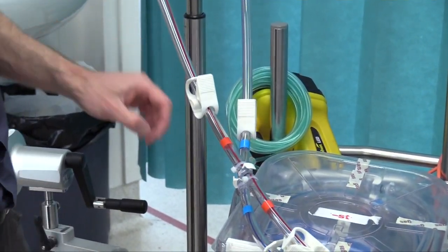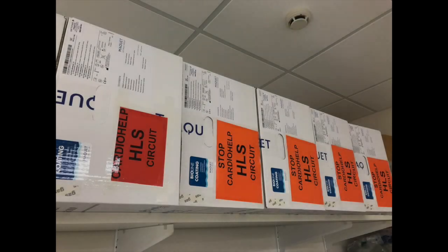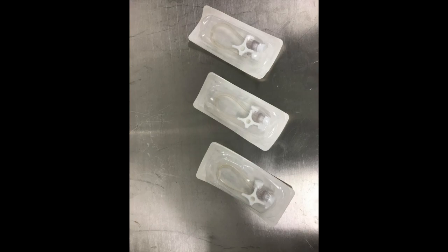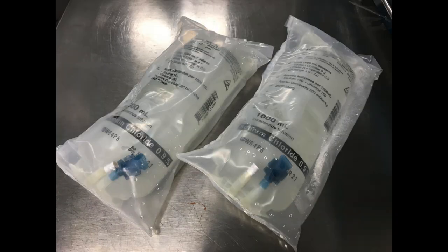First, gather the equipment required. You will need a cardio help pump, an HLS box with a disposable circuit, three three-way taps with extension tubing, a 20ml syringe, and two litres of normal saline.